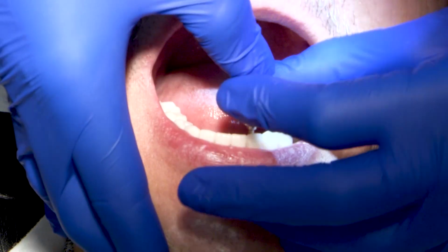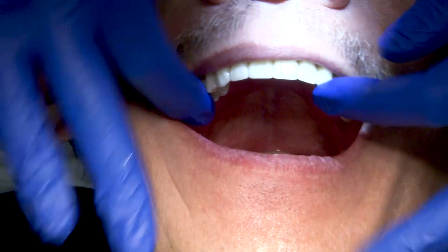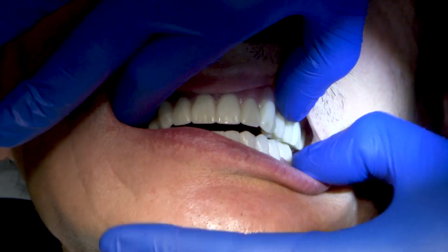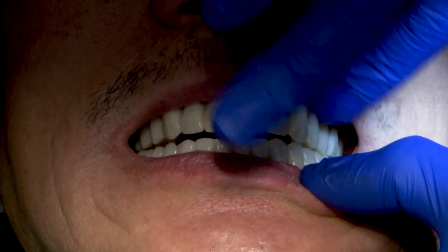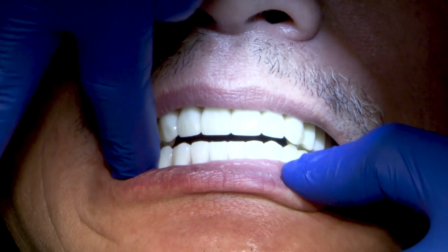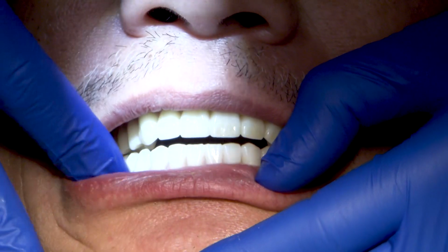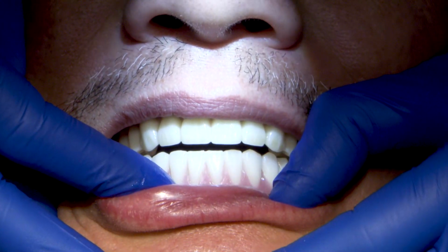As we insert our full arch wax setup, it seems the bite registration might have been slightly off. You can see the teeth do not come together the way we would like them to, and as a result, the vertical dimension seems a little excessive. Have no fear, this happens to the best of us. When this happens, I'm going to simply use the setup to take a new bite registration. But before doing so, I need to get back to the proper vertical dimension and CR relationship.